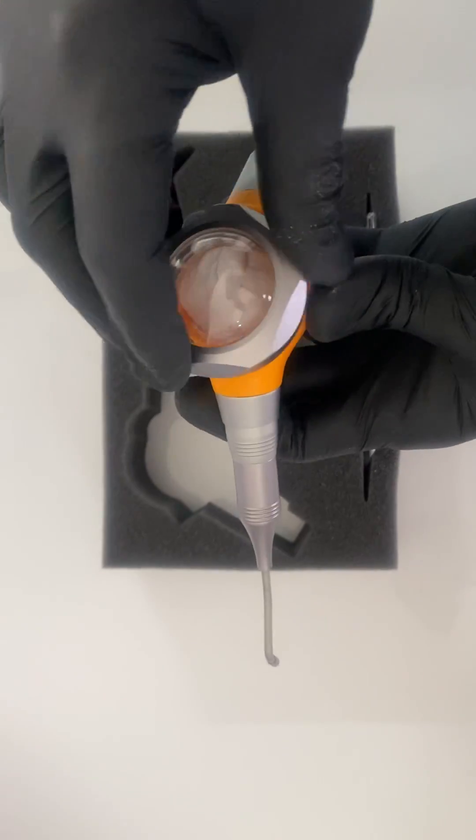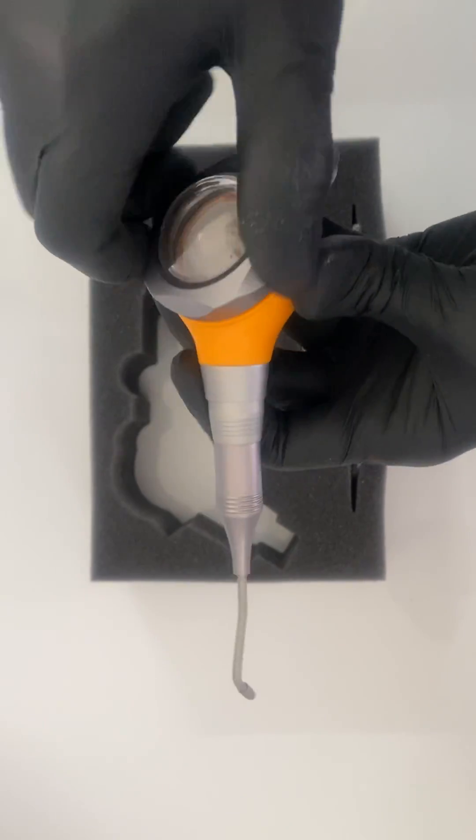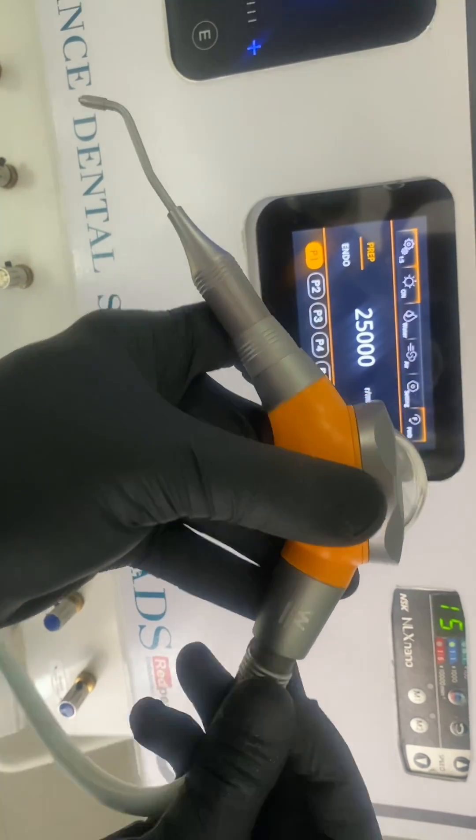This unit can be directly attached to the dental chair, and our chair pressure is around 40 psi.